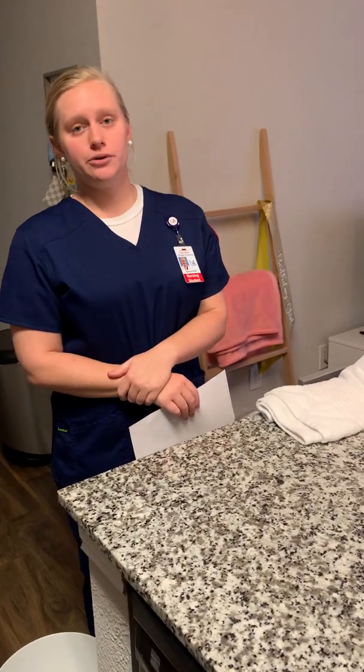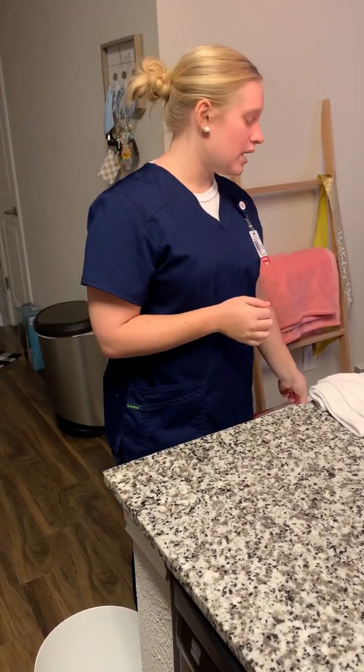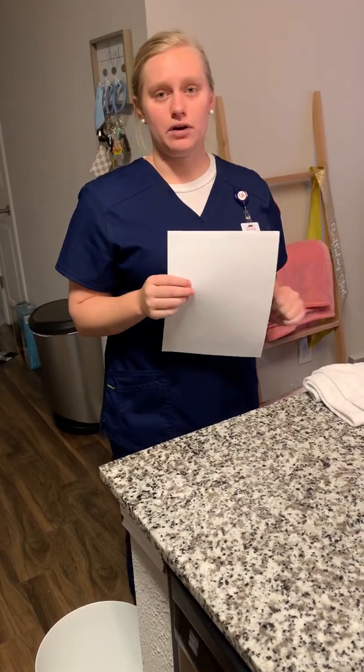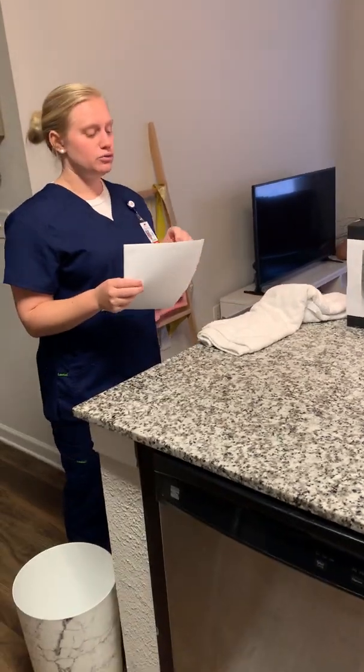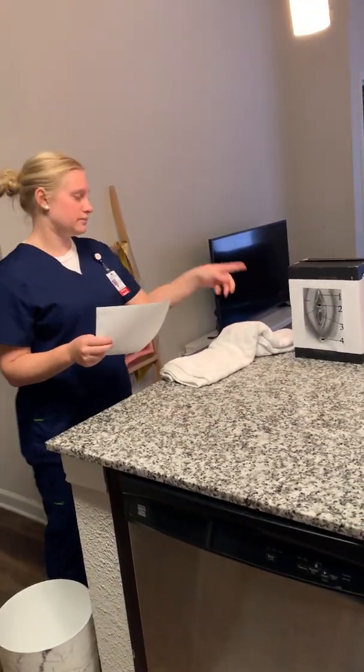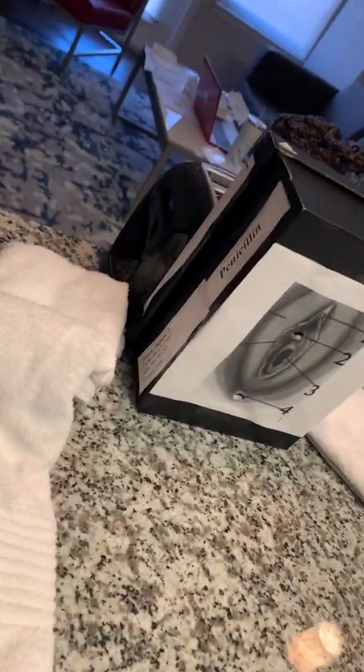The first thing I want to do is verify my order and my hospital policy, and then I will perform hand hygiene, and then I want to make sure this is my correct patient. So I'm going to use my order form and my wristband to make sure this is Miss Jaguar Jones. Her date of birth is 8/25/1963, and then her date of birth on here says 8/25/1963. So this is the right patient.